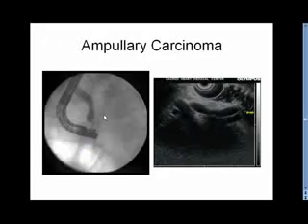This was a patient who was referred after he had been diagnosed with sphincter of Oddi dysfunction, but somehow the lab test abnormalities came back, and this ERCP done by somebody else shows a fairly bulbous termination of the distal common bile duct. On endoscopic ultrasound, you see that bile duct diameter and pancreatic duct diameter are approximately equal, so the main pancreatic duct is dilated. The bile duct is also prominent, but not necessarily big. But here is a hypoechoic mass over the papilla.